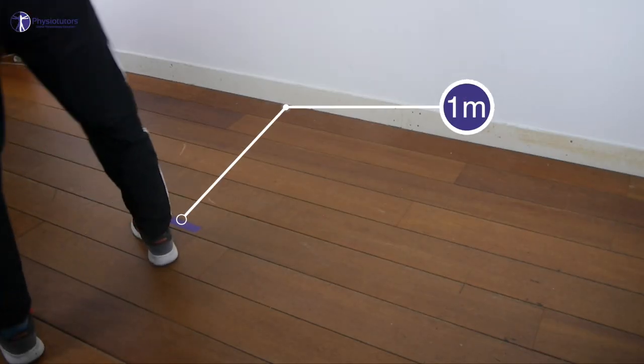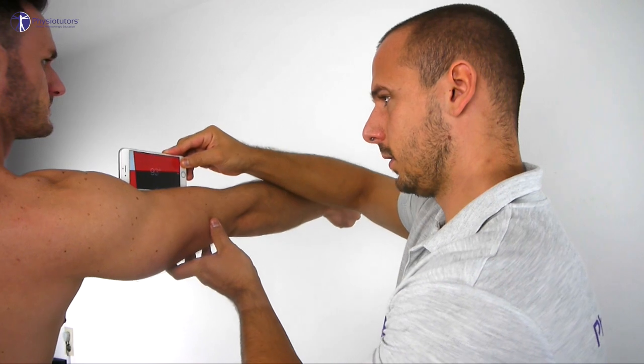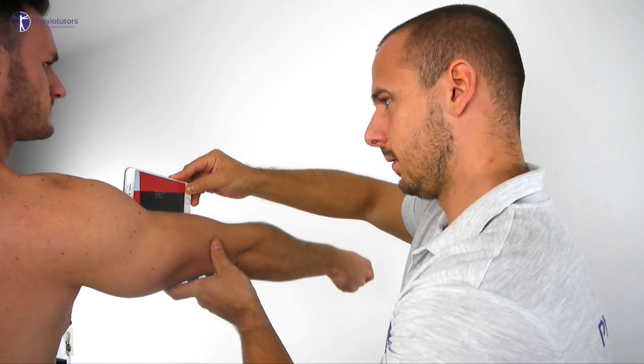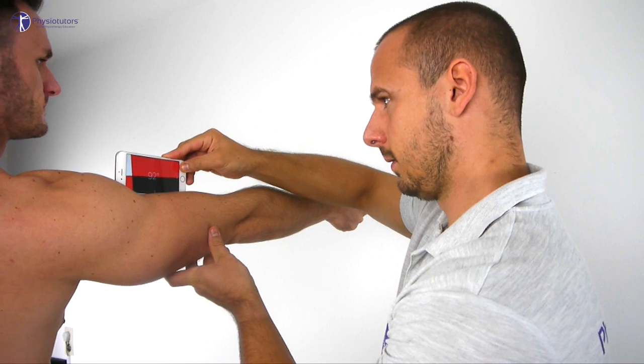For this setup, the patient stands behind a line about a meter away from the wall. With the engaged laser pointer in one hand, they are asked to flex the arm to 90 degrees. You can measure the angle easily and reliably with your smartphone inclinometer.